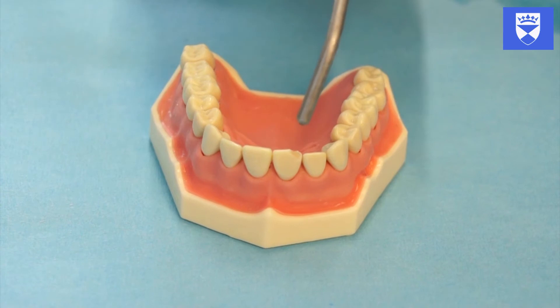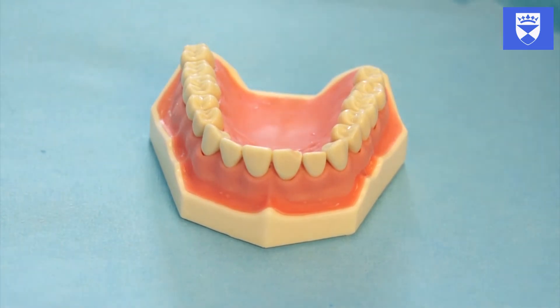It is important that we achieve good moisture control when undertaking this procedure. Rubber dam is ideal for this.